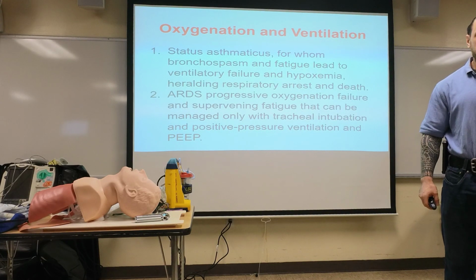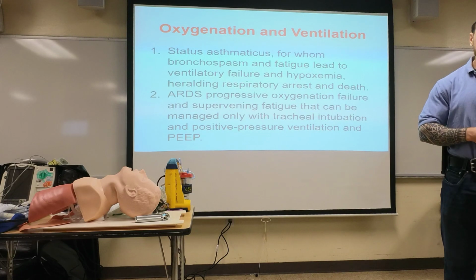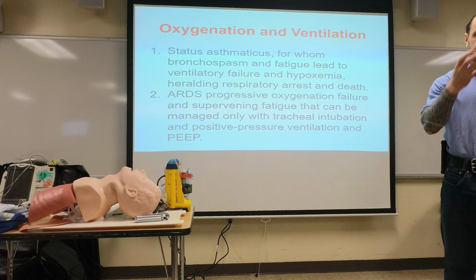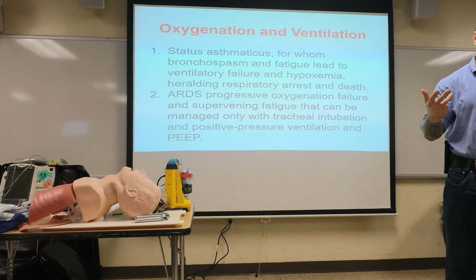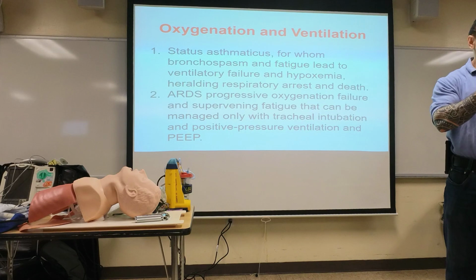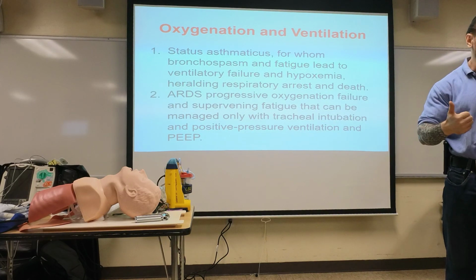No. So when is the best time to intubate? In the hospital setting where they have the paralytics and the video laryngoscopy, so it's safe to do so. Another example: what if you have somebody who inhaled superheated gases? Right now they have a patent airway, they protect it, they don't have oxygenation or ventilation problems, but what happens as time goes by? They're going to swell. Edema. Do you want to intubate that patient when it's all swelled up? No, so we want to do it early.